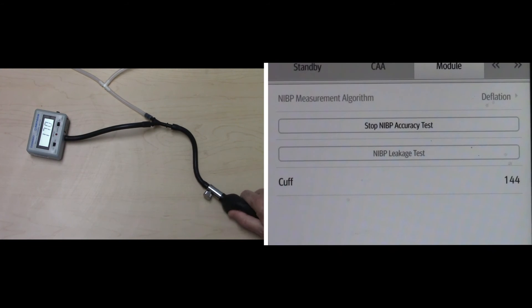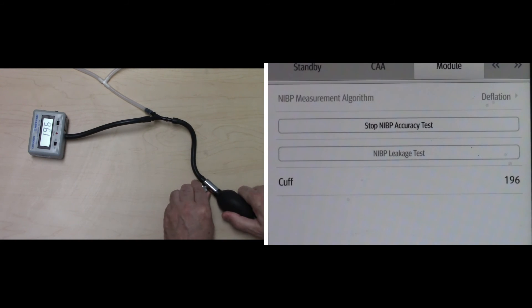Then raise the pressure in the rigid vessel to 200 using the balloon pump. Wait for 10 seconds so the measured values become stable.